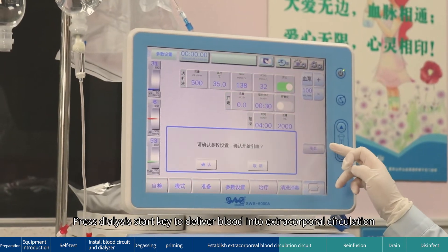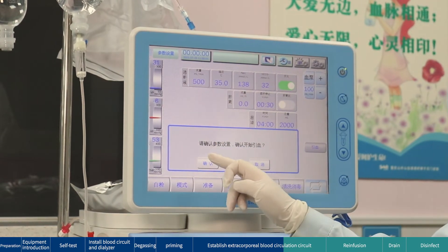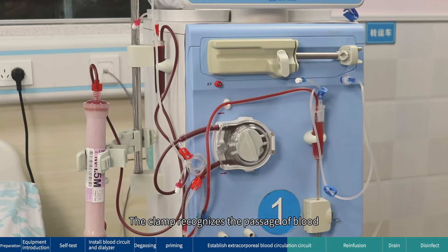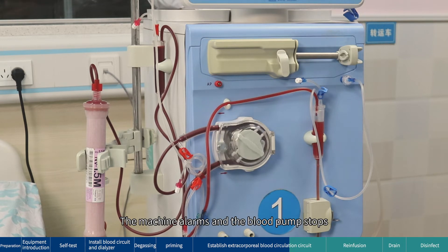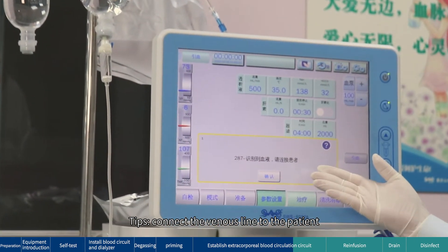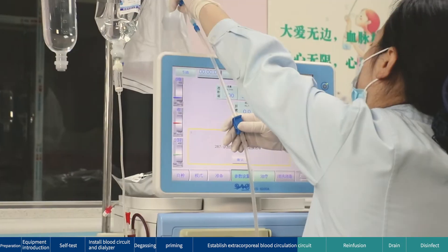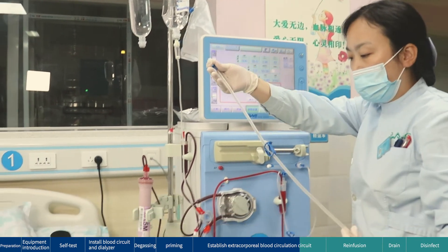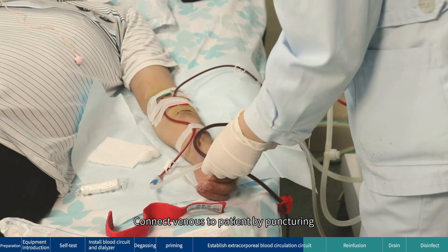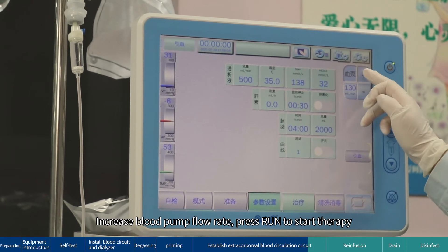Press the dialysis start key to deliver blood into the extracorporeal circulation. The clamp recognizes the passage of blood; the machine alarms and the blood pump stops. Connect the venous line to the patient by puncturing. Increase the blood pump flow rate, then press Run to start therapy.